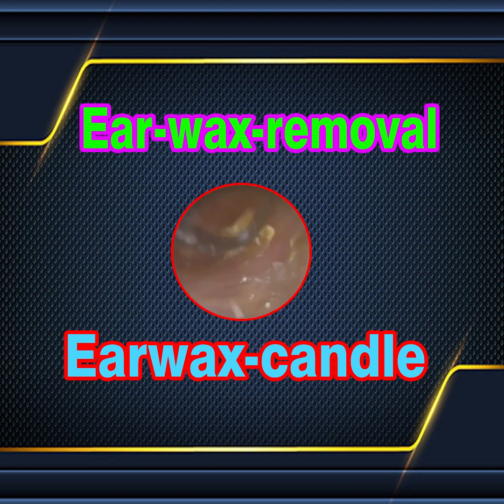Everyone's ears are so unique. So as you're gliding, you've got to account for that upwards trajectory, so you've got to glide upwards. Otherwise, the tip of that Curette is going to bump against the wall and graze it. But you can see we did a pretty good job. I'm pretty pleased with that. There's no bruising, hematoma, or any abrasion caused.